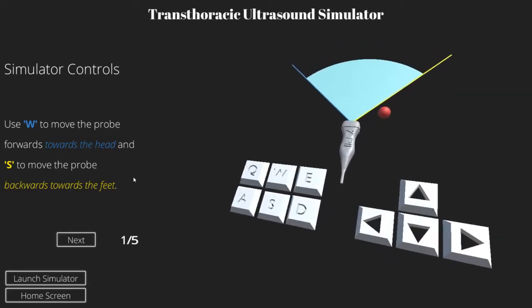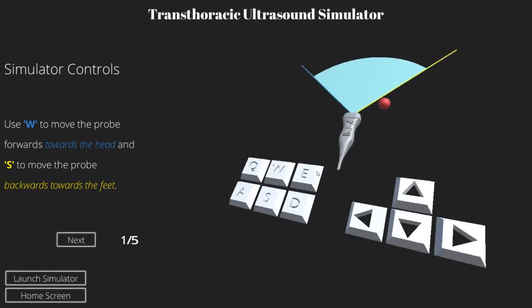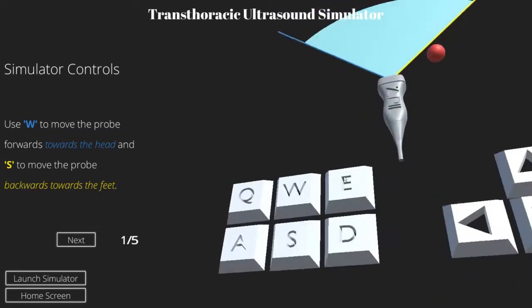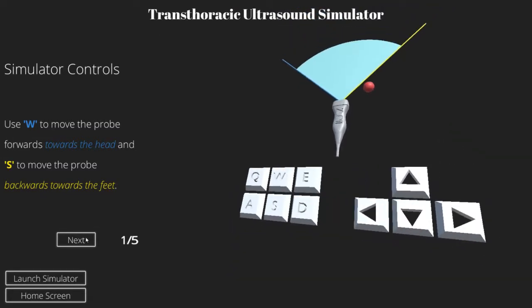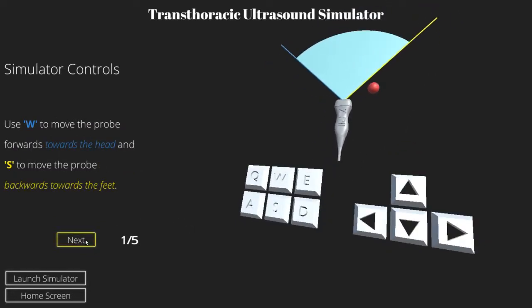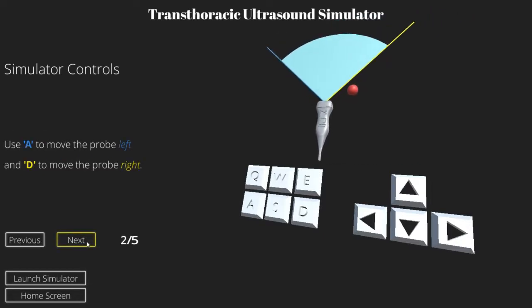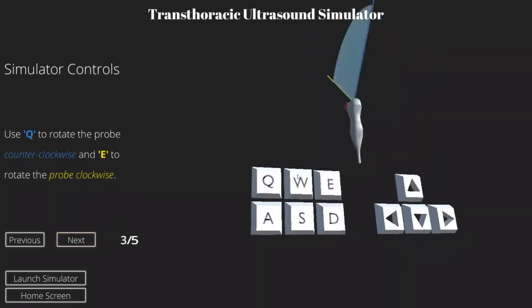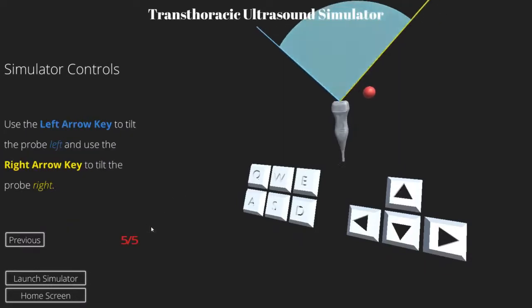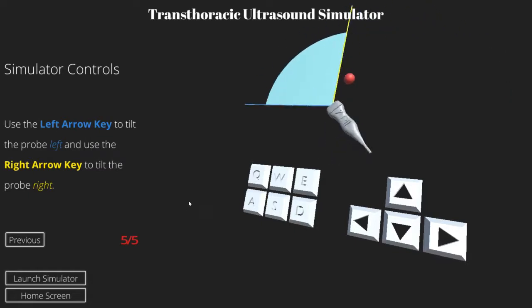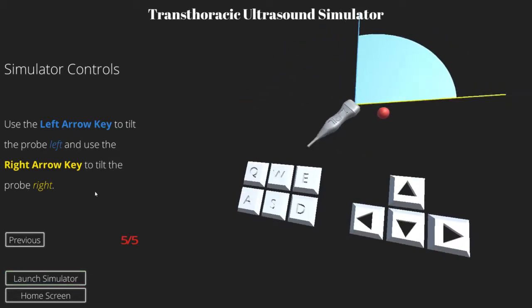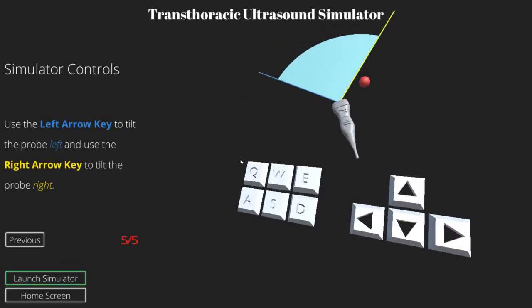So the first screen we're presented with is the simulator controls. This is also a 3D scene and you can play around with it if you want. The keys move so that you know which you're supposed to be hitting. W to move the probe towards the head and S towards the feet. A and D for left and right. Q and E to pitch the plane. Up arrow and down arrow to pitch the actual probe. Left arrow and right arrow to tilt the probe. Once we're comfortable with these video game-like controls, you can just launch the simulator.